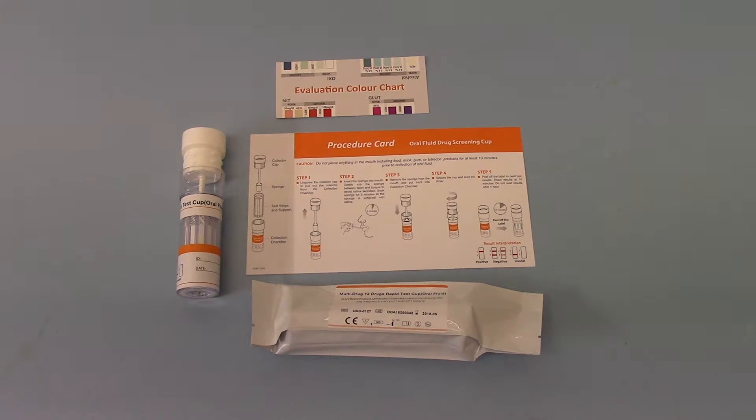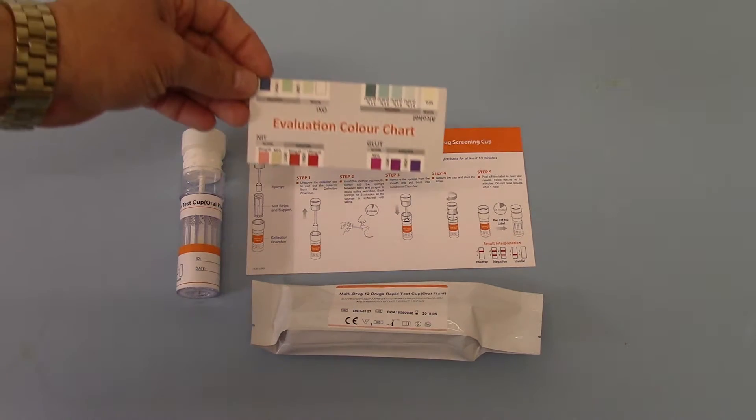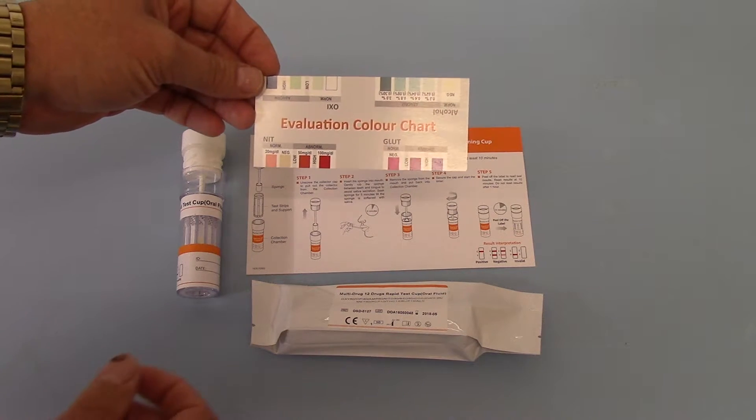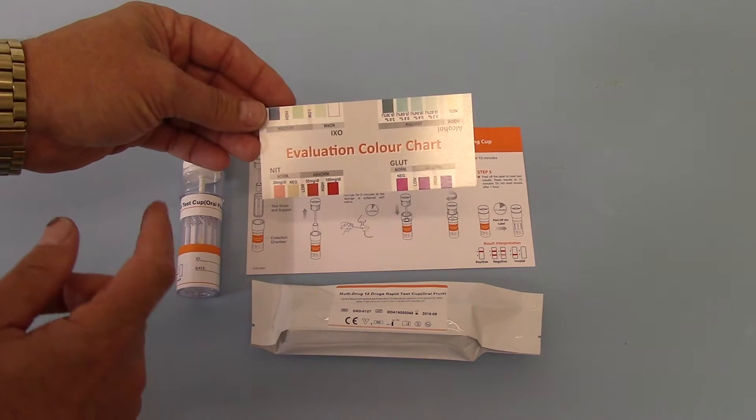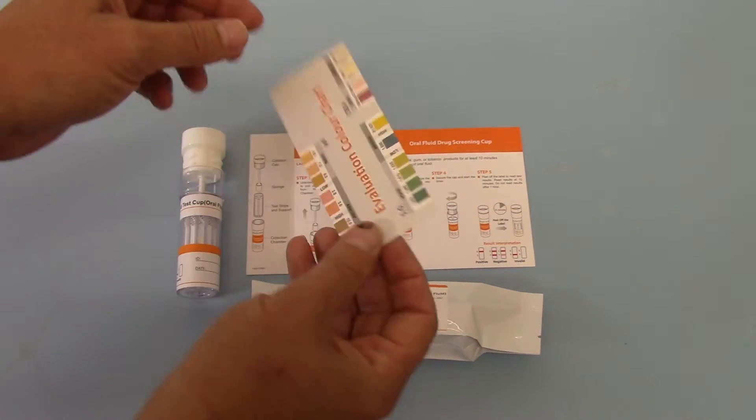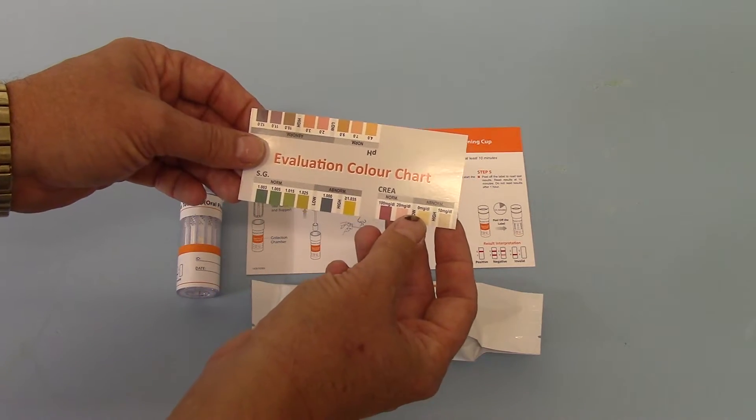The first thing we're going to talk about is the evaluation card which comes with the pack. This is a generic evaluation card which includes tests which aren't included on this in addition to the alcohol test which is. This is a screen for adulteration analysis where an adulteration test is included mainly in urine drug tests.